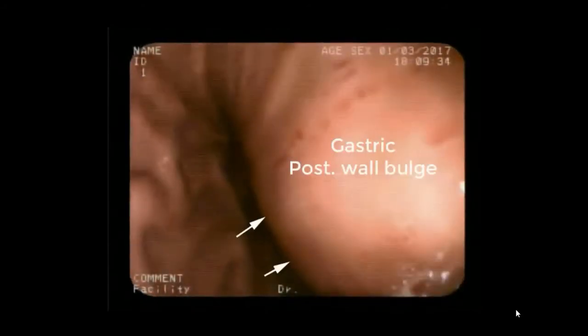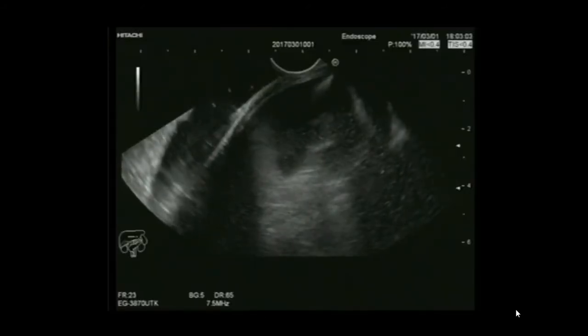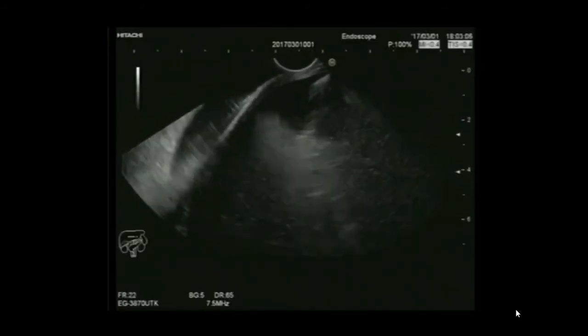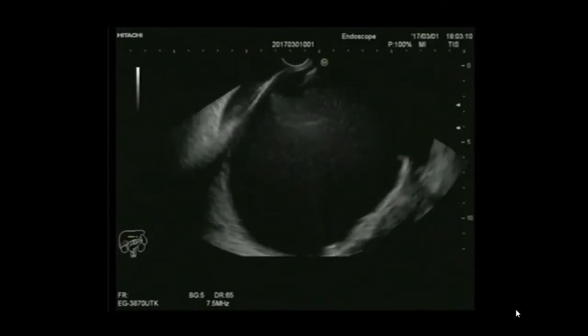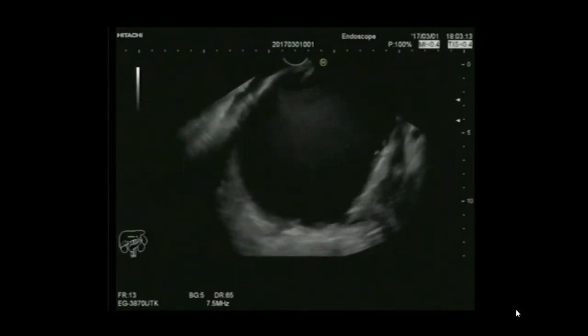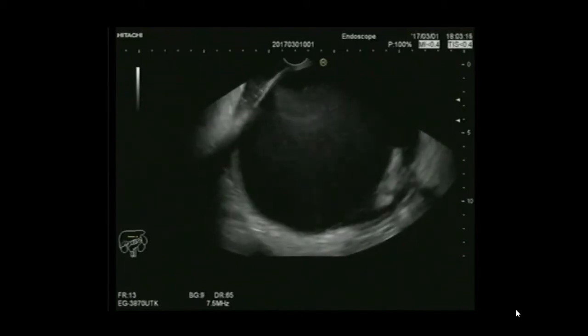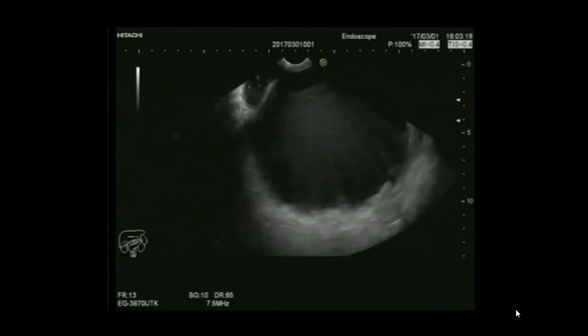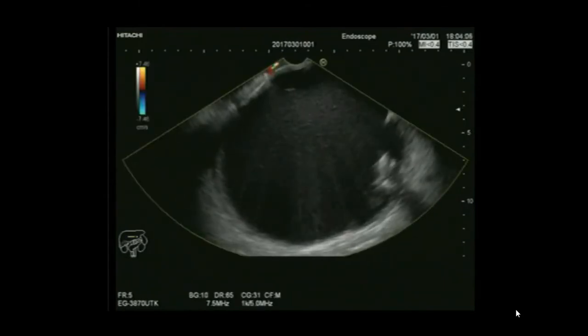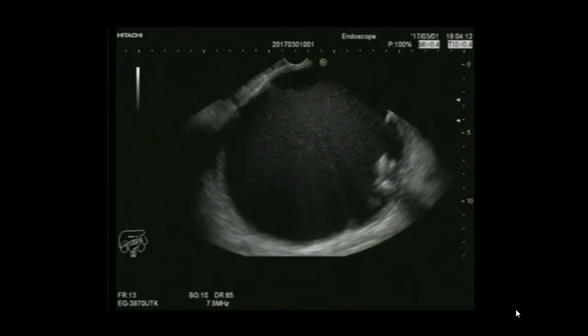In the video clip, we first assess the endoscopic picture, looking at the bulge of the cyst into the gastric lumen and choosing a point of entry with the echoendoscope. We then assess the cyst under EUS — endoscopic ultrasonography — evaluating its size and the thickness of the cyst wall to be punctured, looking for a suitable entry site.